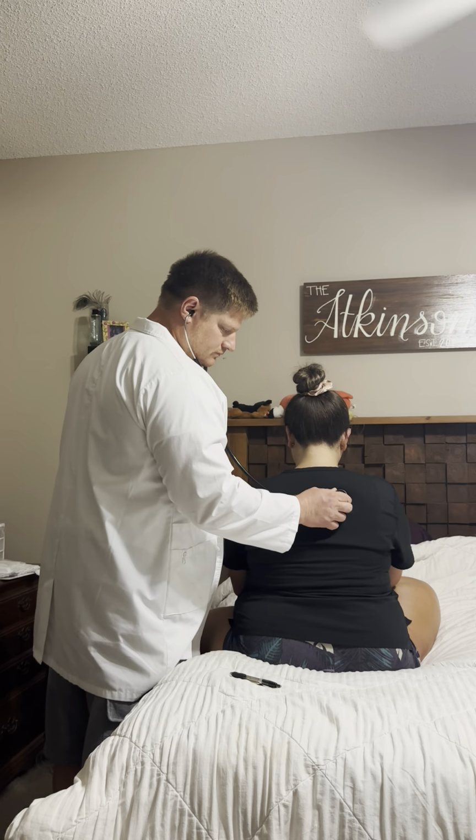I think there's only one last test that I'd like to do for you, and this is called checking for egophony. And I'm going to listen to you just like I've been doing. And all you do is just verbally say the letter E. And I'm checking to hear if it changes in octaves or sound. If I hear your E start to sound like an A, this can indicate consolidation in the lungs, fluid buildup, pus, blood, edema, things of that nature, all of which are abnormal.